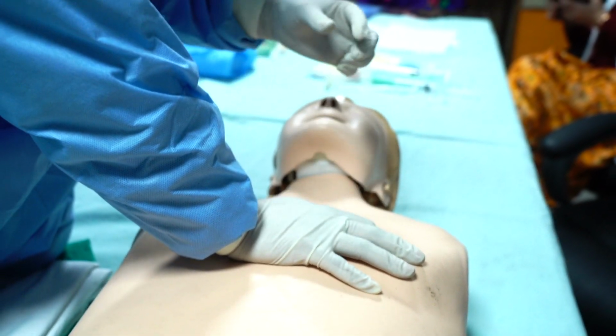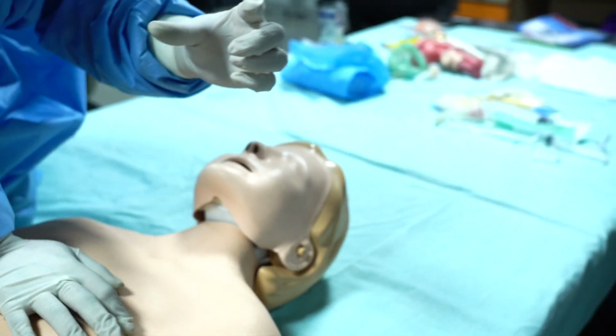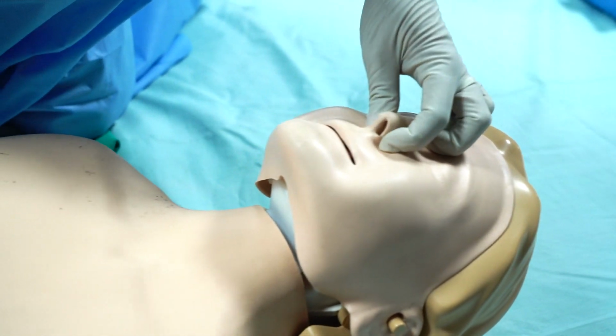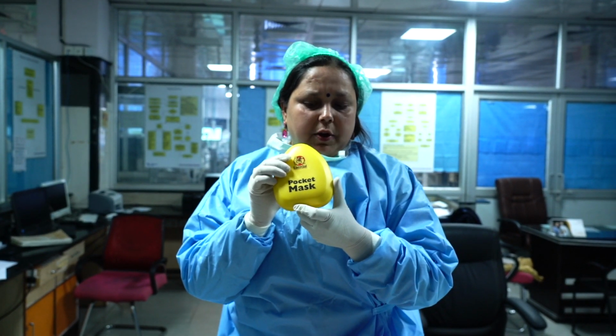For giving the breath, we have to close the nose with the help of the thumb and the pointing finger, open the mouth and give 2 breaths. For giving the breath, we can use the pocket mask or give mouth to mouth. After 30 chest compressions, give 2 breaths with the help of the pocket mask. So how to use this pocket mask?